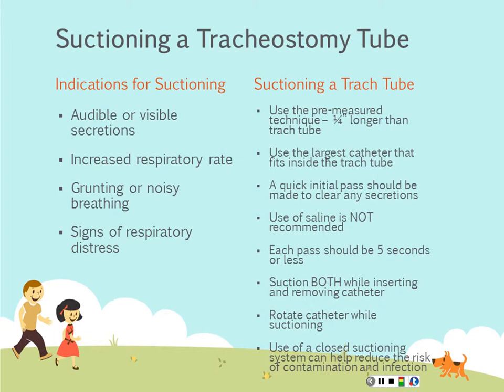So in suctioning a trach tube, you want to use the pre-measured technique. You don't want to go any further than 1/4 inch longer than the end of the trach tube. Now, you can use a new trach and measure that for yourself. A lot of times on the trach box, it will tell you in the instructions how far you can measure.